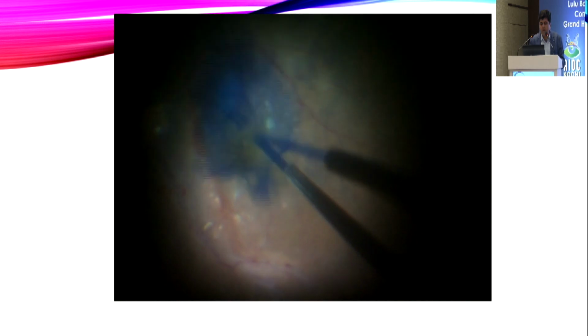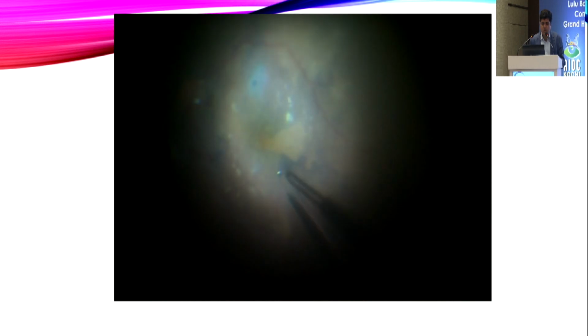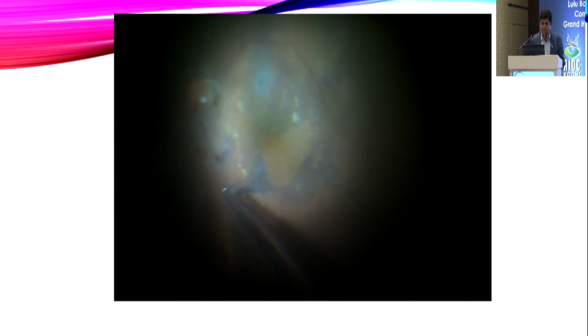We can't have a normal macular hole ILM peeling. Again, restaining was done to find the remaining ILM. The peeling was done and the surgery was completed with laser.